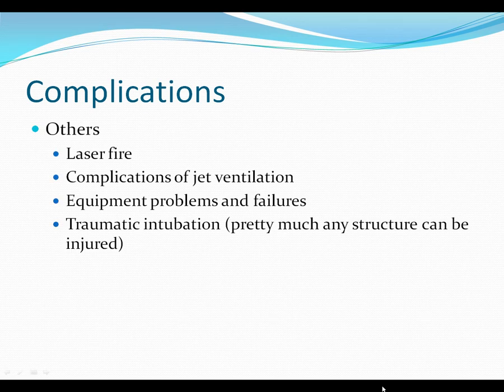Other complications, laser fire. Has anyone done a laser case? So there is a laser tube, right? Did you use a laser tube for that? It's not a surefire guarantee that you won't have a fire, but it certainly helps. And then did you decrease the FiO2? Yeah, so get the FiO2 down as low as you can for those. That's the idea of the laser fire.